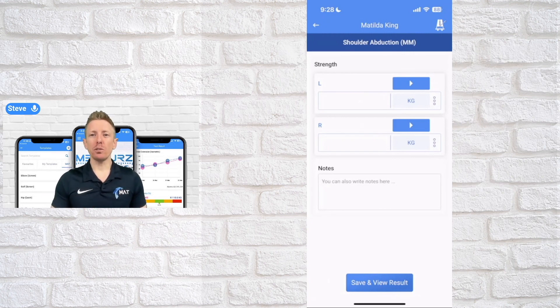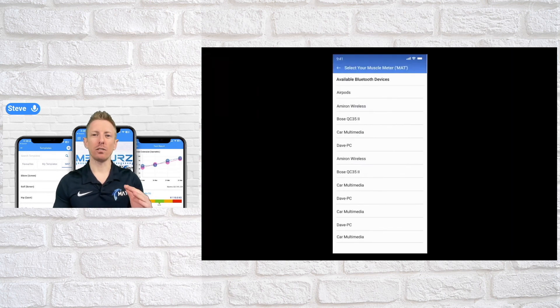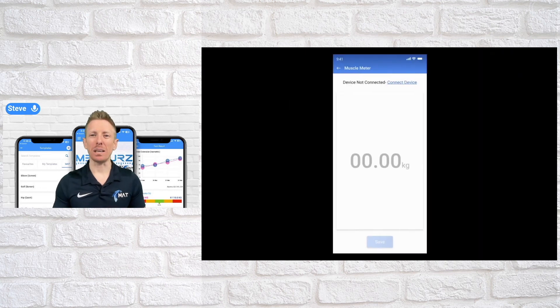The first time you run a test with your muscle meter, it'll ask you to connect your device when you hit the play button. It'll show a screen saying 'connect your muscle meter' — push that button and it'll take you to a list of all available Bluetooth devices, where you select the device named 'MAT' in the list. If your device isn't connected for any reason, the numbers will be grayed out with a 'connect device' button — just tap that to reconnect.